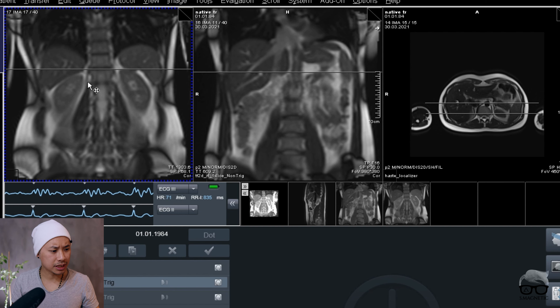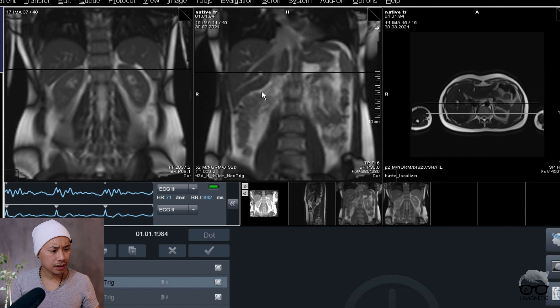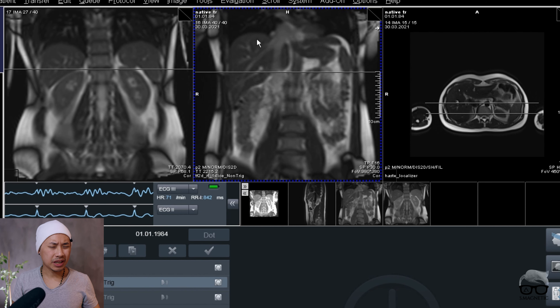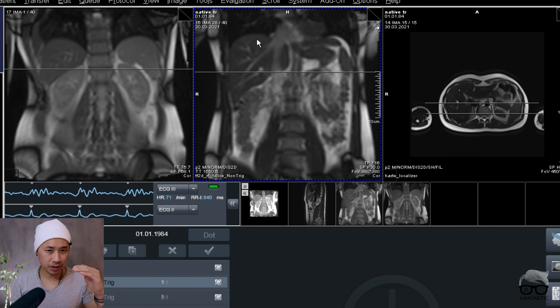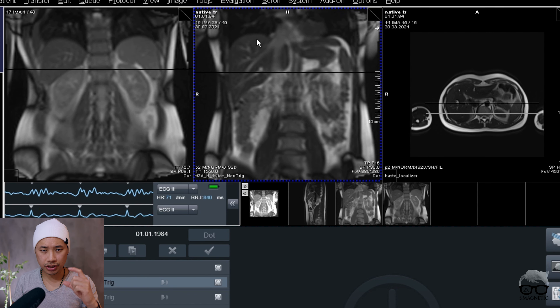For the kidneys, let's say you're going to do a native TrueFISP but you need to know the exact position for the top and bottom of the kidneys, because adding extra slices will prolong the scan time. With this dynamic localizer you're able to see the top and bottom of the kidneys. And when it comes to the liver, whenever you're doing MRCP or respiratory-triggered sequences, you'll know the exact position of the highest and lowest parts of the liver, making it easy to position your navigator — so it can be very useful.